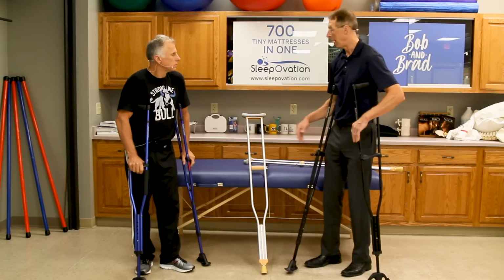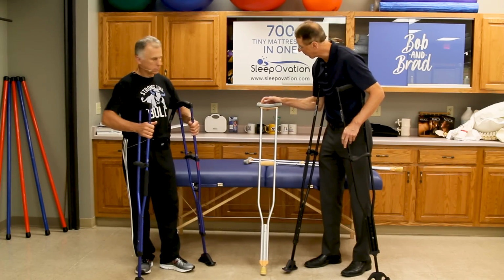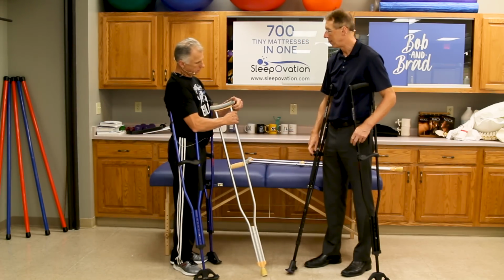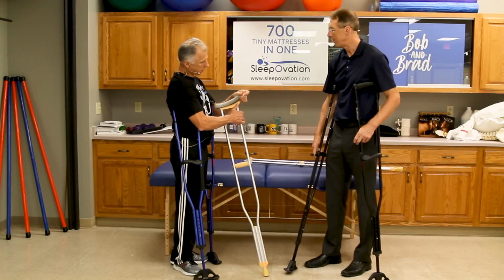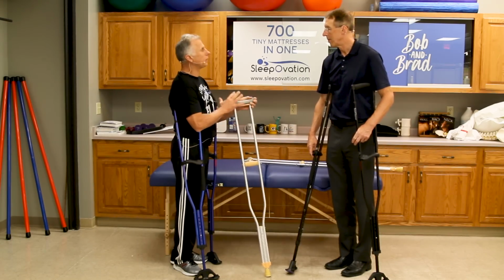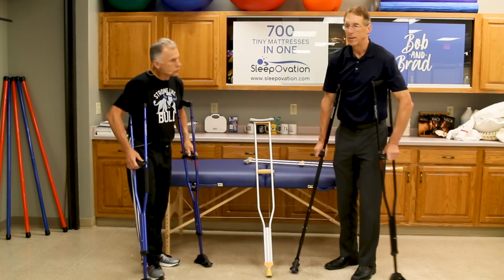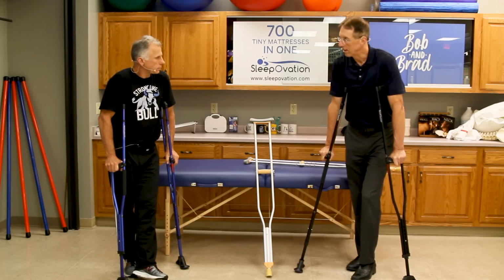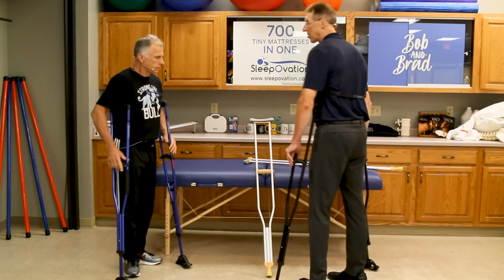And the thing is, the way it's designed, you get some really sharp forces right here and right here. You can see it when you take the pad off. Yeah, look at it. This is hard plastic, and then they put a cushion on there. Granted, there are different cushions that you can modify and stuff for those too, but these shouldn't need that.